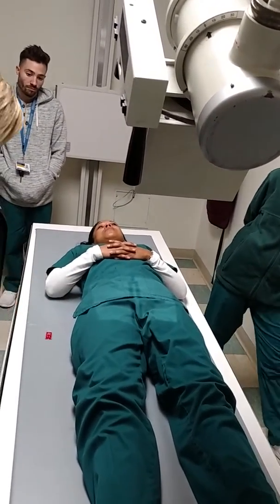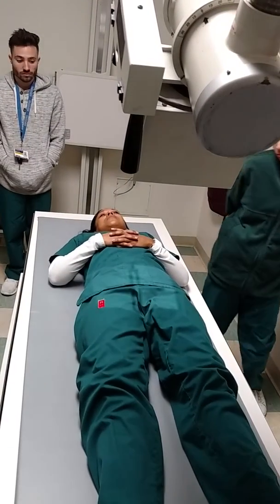So there's that. Down the middle, 1 to 2 inches below ASIS. Hold your breath, beep.